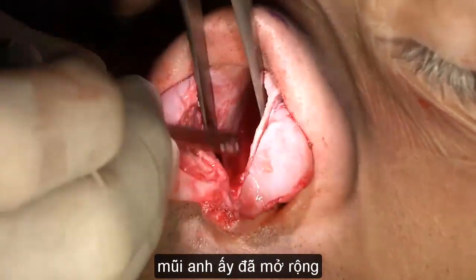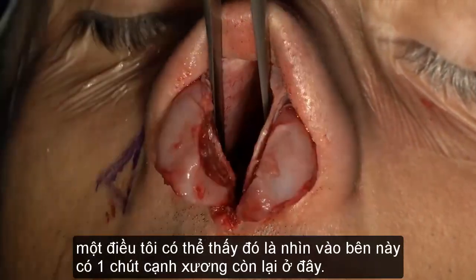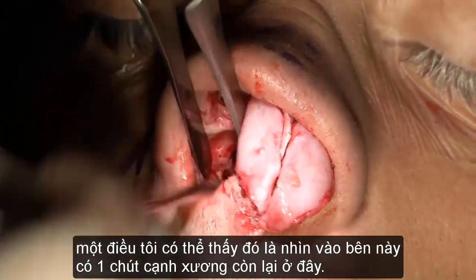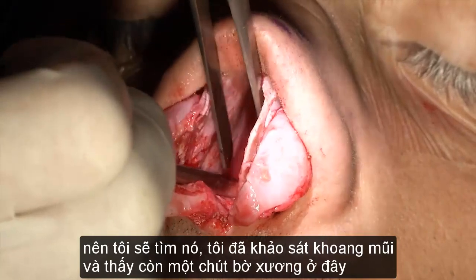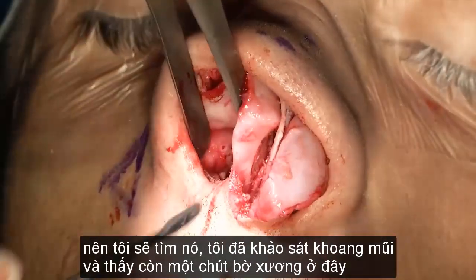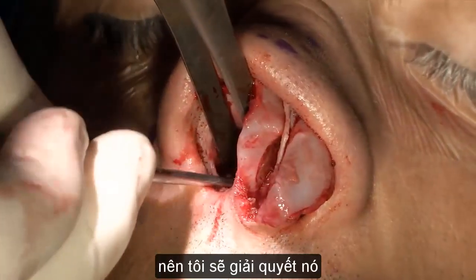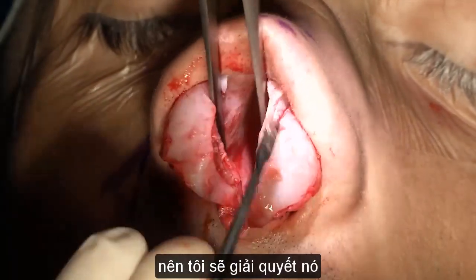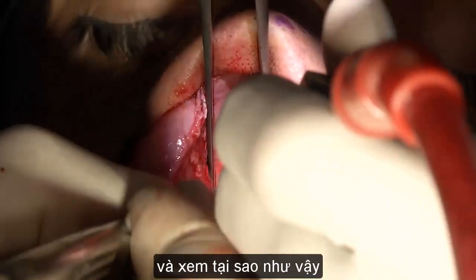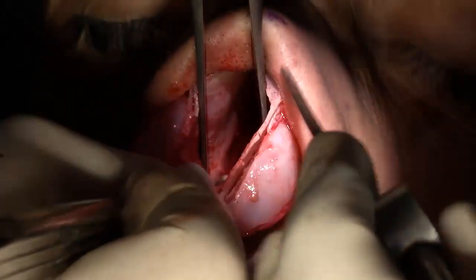Now one thing I can see, this is interesting, looking at this side, there's a little bit of a bony ledge here. So I will look for it. So I was inspecting the cavity. I saw there's a little edge here. So I want to actually take care of it, and see why. Here it is.